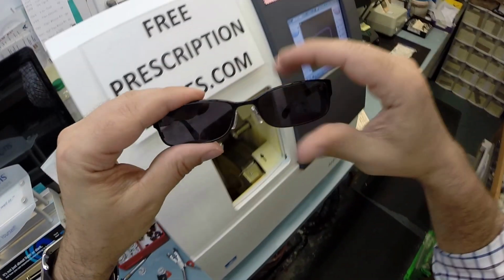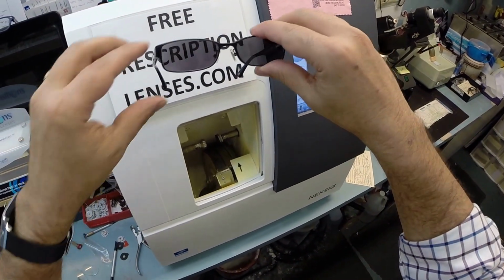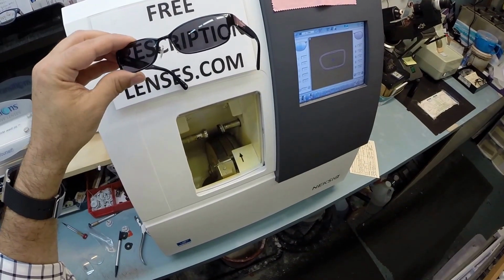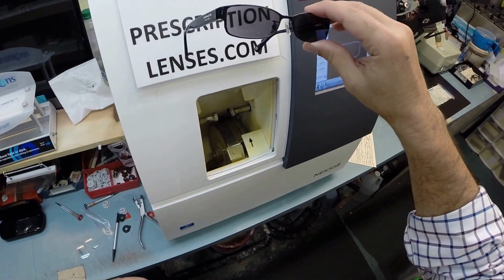Also, they're temperature sensitive, meaning that when it's 85 degrees and below, they will get darker than they will when it's 95 and above. When it's 100 degrees outside, you're miserable, they're miserable, everyone's miserable.